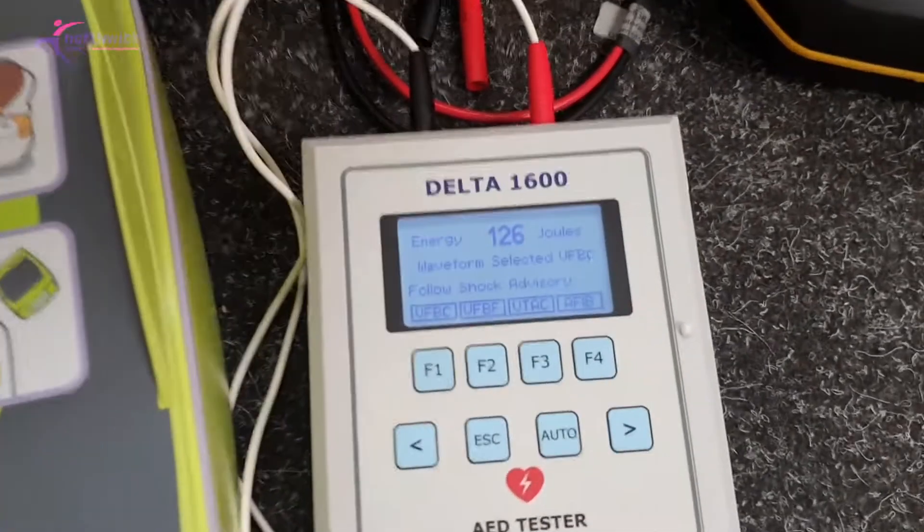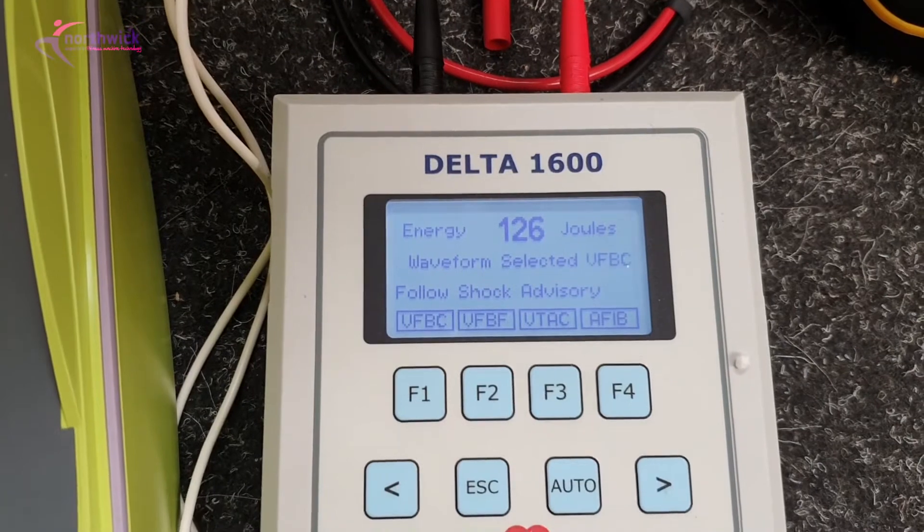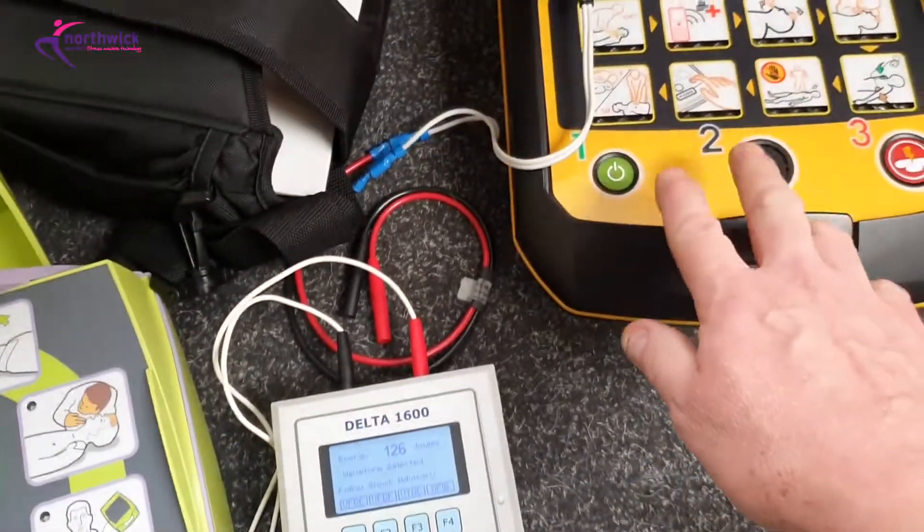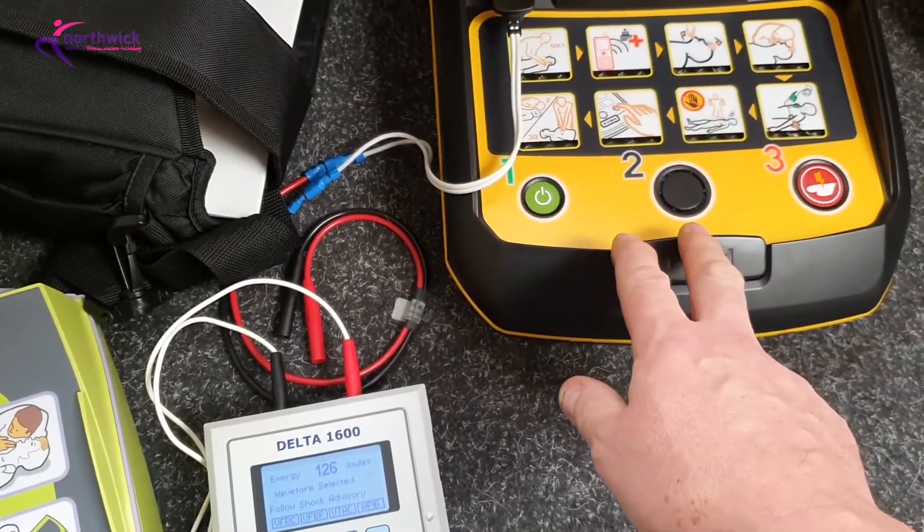Don't touch patient — shock delivered. Start CPR. Shock delivered: 126 joules. So clearly the instrument is working correctly. The problem is this other device was telling you it's okay — but clearly it's not.